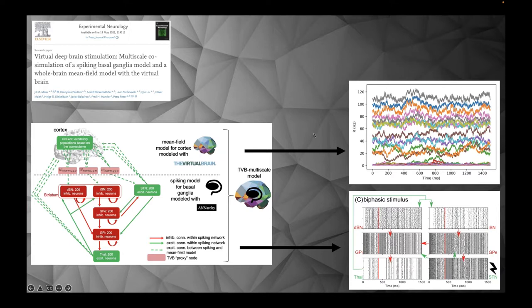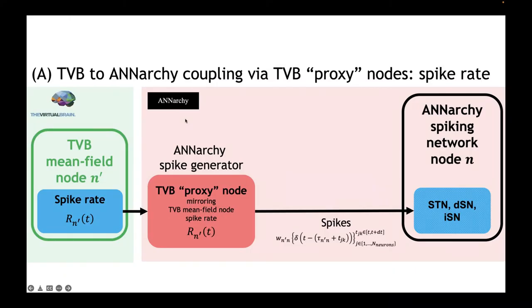Okay, another question, about the target in the notebook that you showed in the first example. The notebook that I showed, the target was the region number 12. And all you would have to do is put in con.region_labels to see all the region labels and then find your 12th region label. Actually, it's Python, so it's your 13th region label, because it starts at zero. So easy for you to find out as the homework.